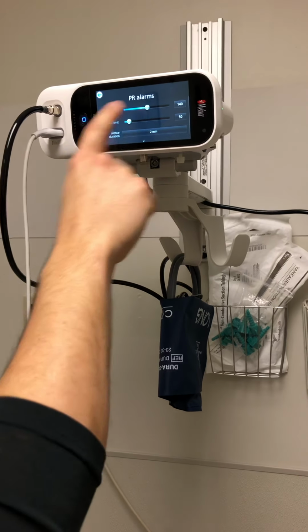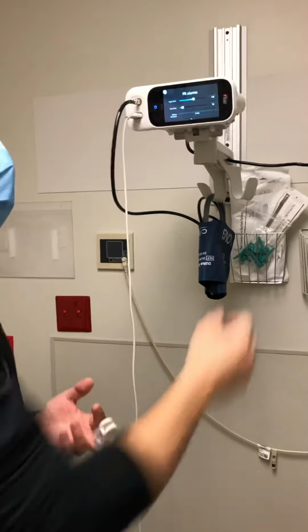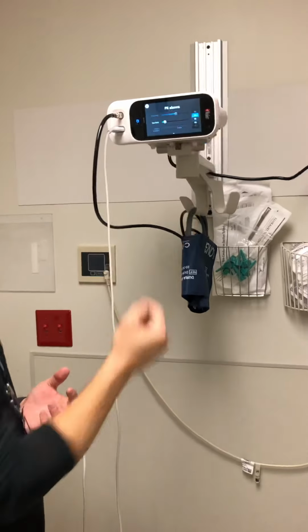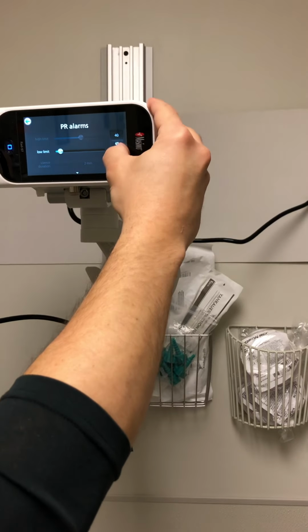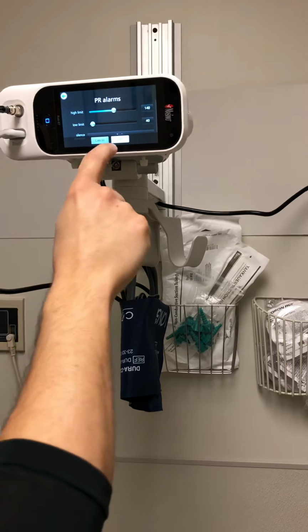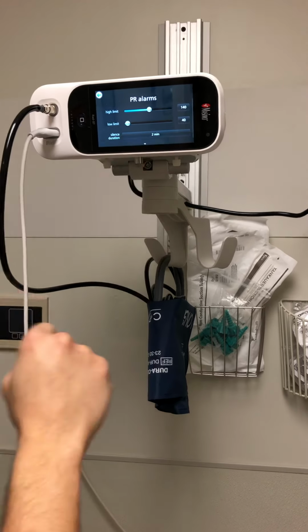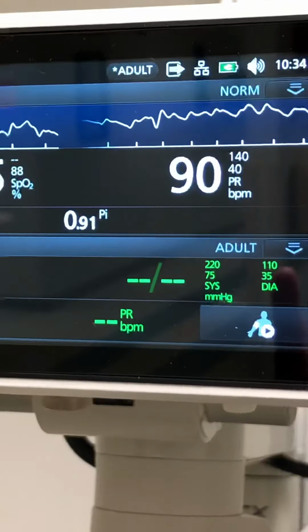You can use the scrolling bars. I often find that the numbers change a little bit too quickly for myself. I like using what we call the Price is Right wheel over here. It's just a button push, and then you can scroll it down, you can scroll it up to whatever you need to change it to, okay? Now, because I'm making a change away from the system default, I click OK.